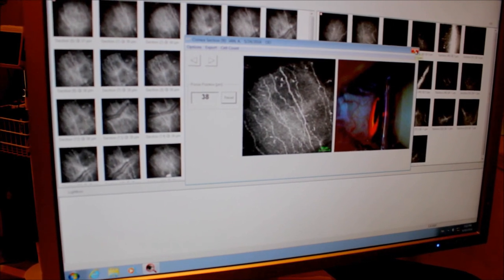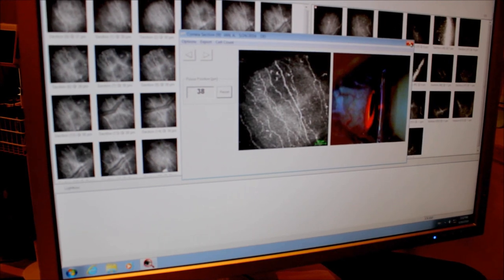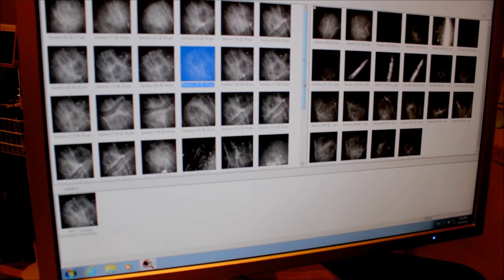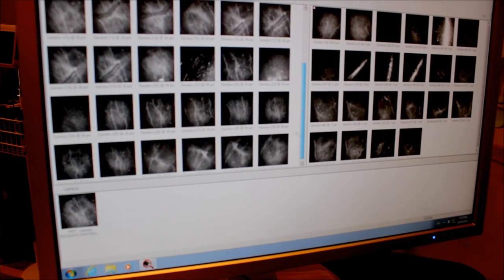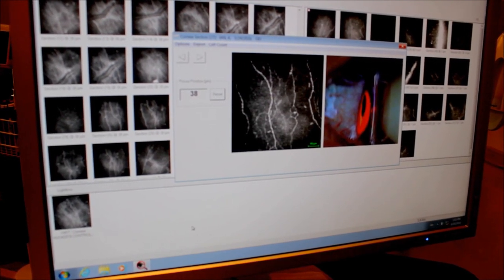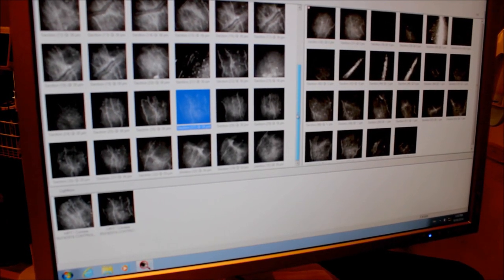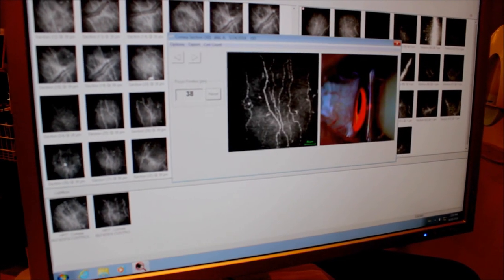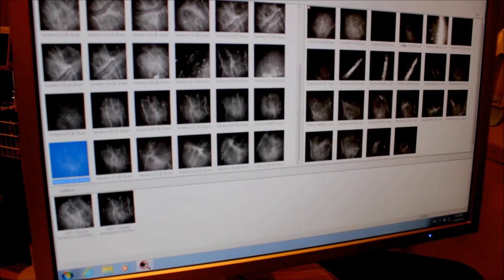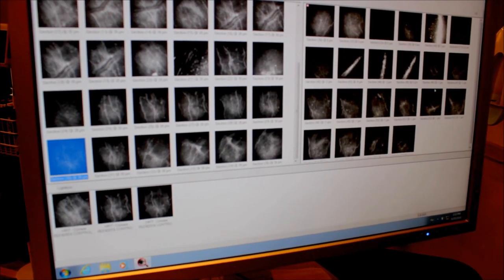As we've explained in the previous videos, we make sure there's no pressure lines, the contrast is good, and you can clearly see the nerves. I would choose this image, and then I guess I would choose this one, which is slightly lower, to establish my minimum for the range. And then I would like to choose something that is perhaps in between, like this one, which is going to be my middle image, my average. Then we're going to repeat the process for the other eye.